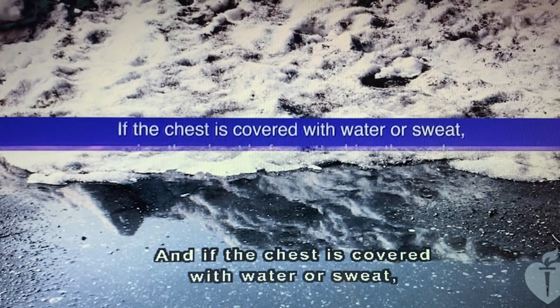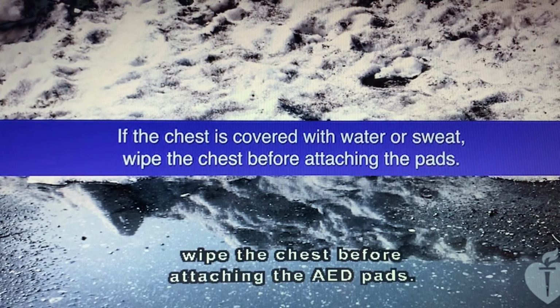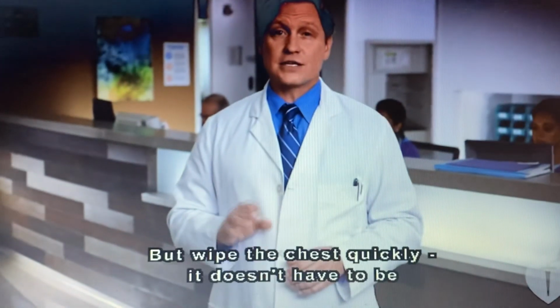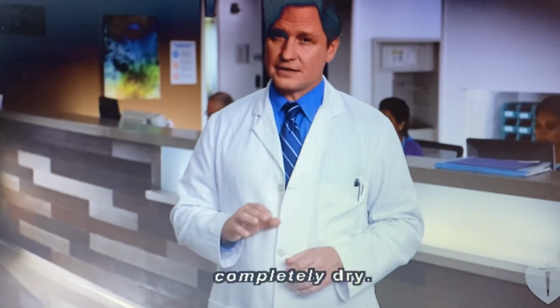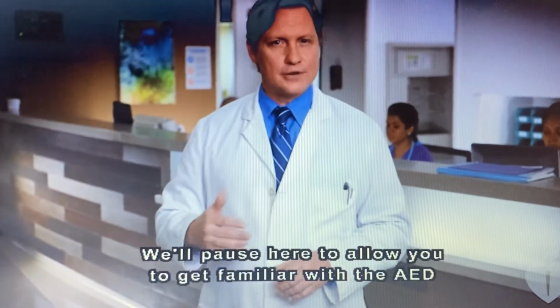And if the chest is covered with water or sweat, wipe the chest before attaching the AED pads. But wipe the chest quickly. It doesn't have to be completely dry. We'll pause here to allow you to get familiar with the AED.